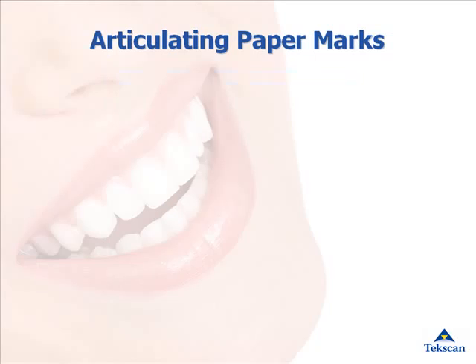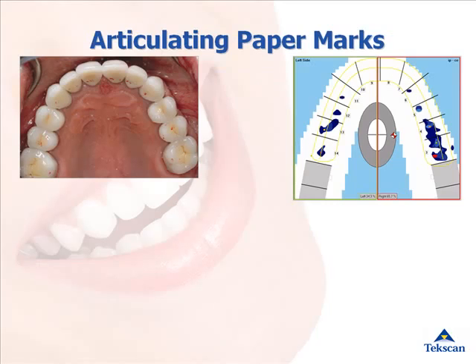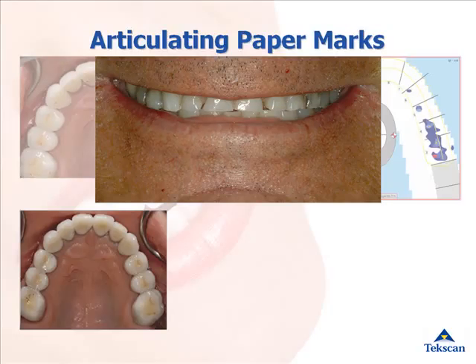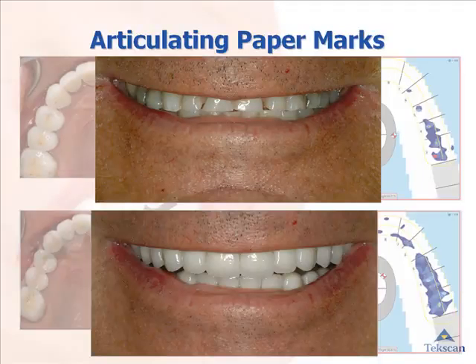The reality is articulating paper and waxes provide limited information on contact timing and force. The T-scan system can provide more accurate data, allowing you to precisely optimize occlusal contact patterns. When dentists perform occlusal adjustments using the T-scan system, they can obtain optimal occlusal results. By revealing the sequence of tooth contact and its force, the clinician can make proper occlusal adjustments, enhancing the longevity of restorations.